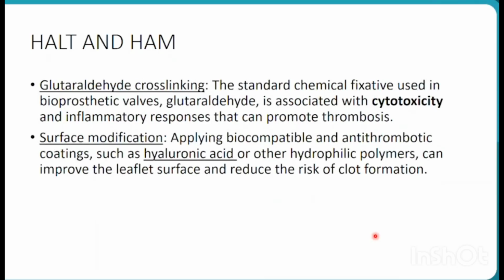Why there is HALT and HAM is because of the standard chemical fixative glutaraldehyde that was previously used, which used to cause cytotoxicity and inflammatory response at the site of implantation. So what we can do is use, instead of glutaraldehyde, biocompatible coatings like hyaluronic acid or other hydrophilic polymers that can improve the leaflet surface and reduce the risk of clot formation. And if we are suspecting HALT or HAM using MDCT imaging, then the treatment of choice is anticoagulation.